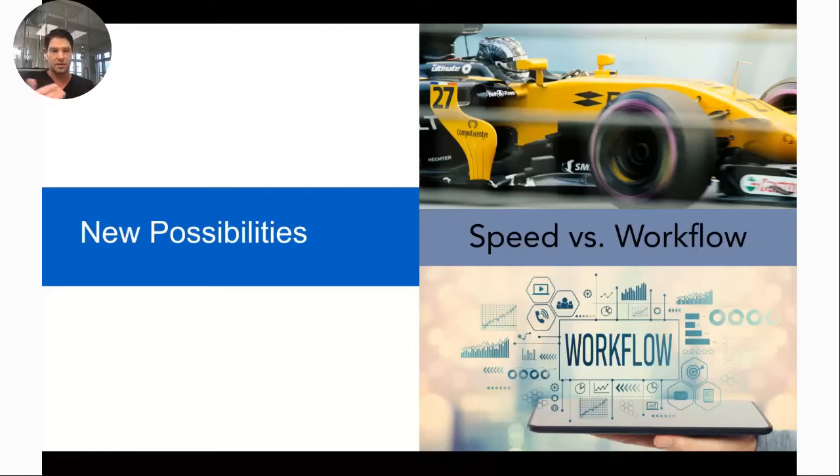At lunchtime, the assistants would then process those models, hit print for the next models to be printed. And then before they leave that day, they post-process those models. They hit print overnight. Morning, they come in. And so it basically broke my day up where speed wasn't a big issue, other than for same-day retainer delivery and if I wanted to do same-day aligner delivery.